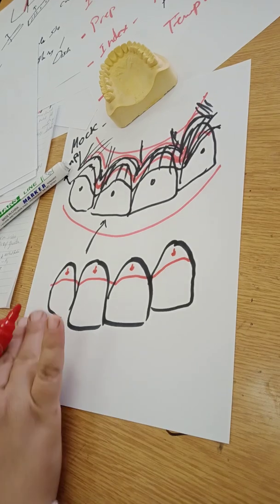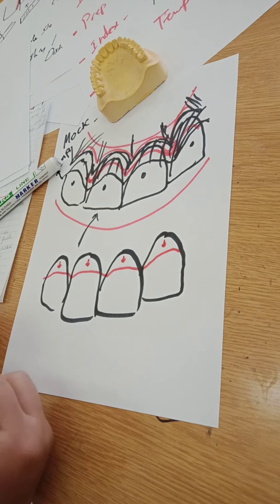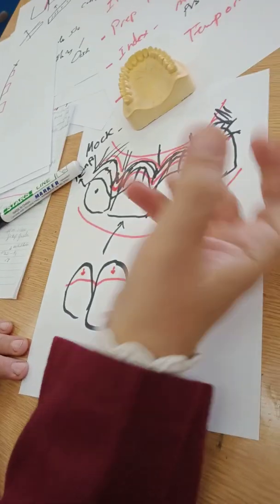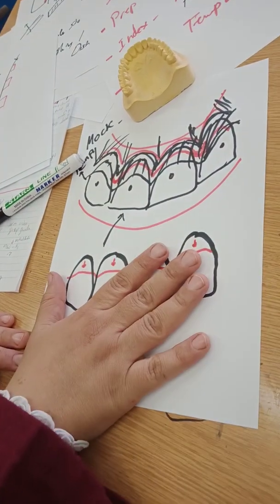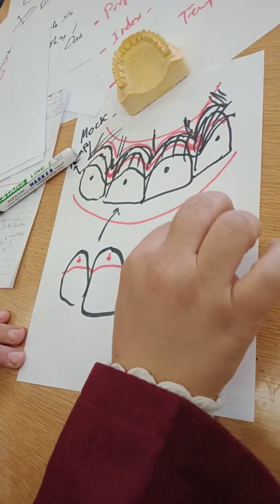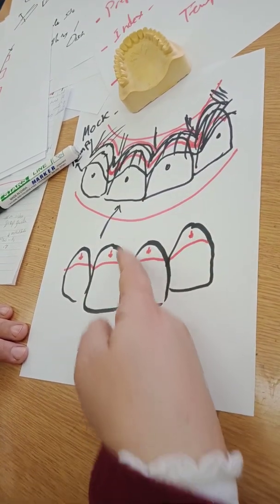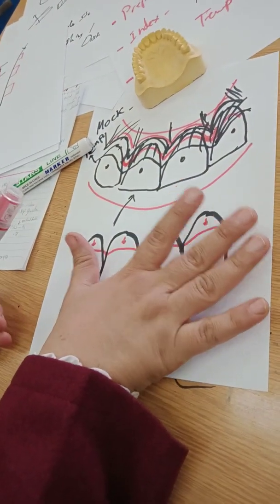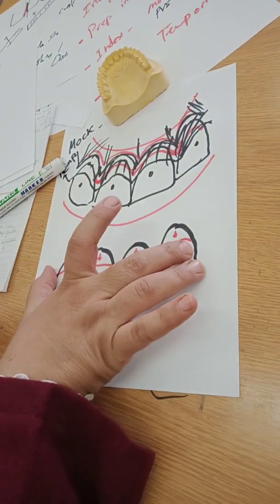This is exposed. All of these are connected and well attached by the bond and pinpoint acid etch. But why do we leave these? Because we want excellent long-term temporization. This is the sheer side temporization. If I make them with the mock-up material and cover up to here, I do not control my finish line. If I want to control it, I might come with the bur and cut from it, so I ruin my finish line. And I need long-term temporization, and the veneers will not be ready for maybe 1 or 2 weeks or even more. So I want long-term temporization.